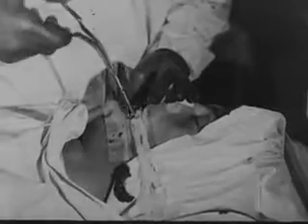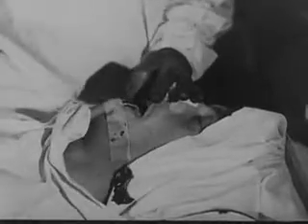Here we see the end of a nasal operation. During the course of the operation, the pharyngeal pack has prevented blood from running down towards the glottis. When the pack is removed, suction is used to clear away any blood which may have trickled down from the nasopharynx.